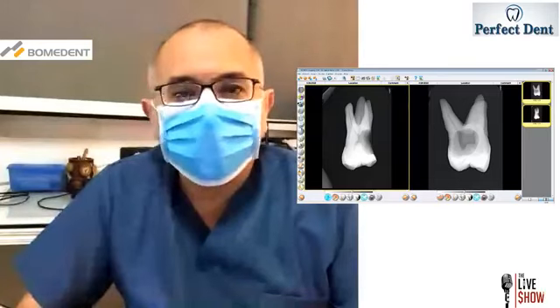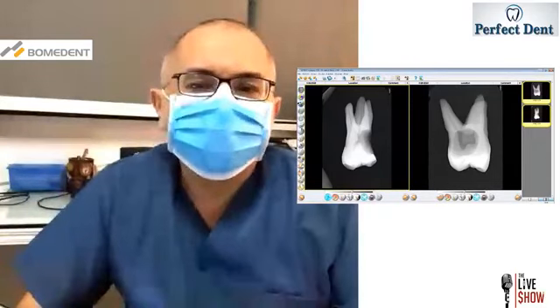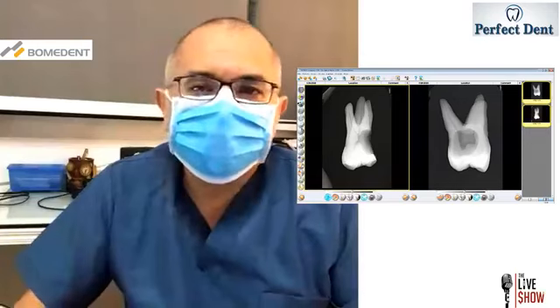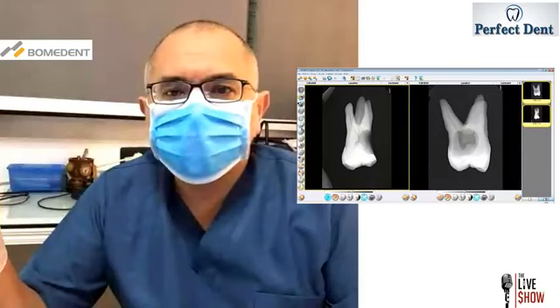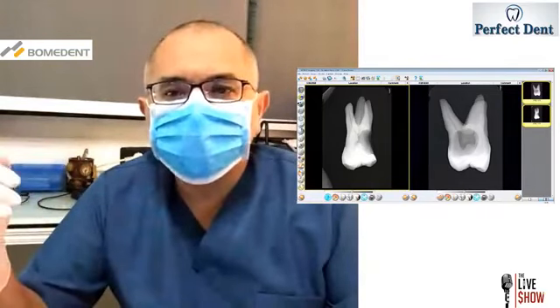This is a very useful lecture for undergraduates and newly graduates on how to deal with a regular root canal treatment. In it, I'm going to be doing an access cavity, obviously. I'm going to be negotiating the canals, and I'm going to show you the preparation and obturation of one of those canals. Now, you can see on the right here the x-rays. I took x-rays in the buccolingual dimension and in the mesiodistal dimension. So this is the tooth that we're going to be dealing with.